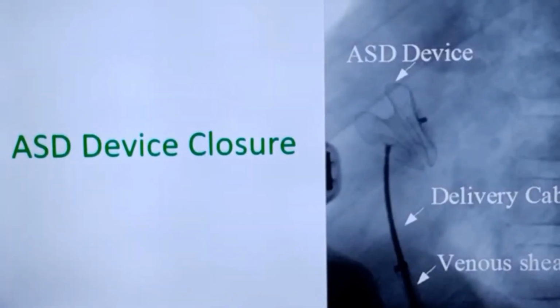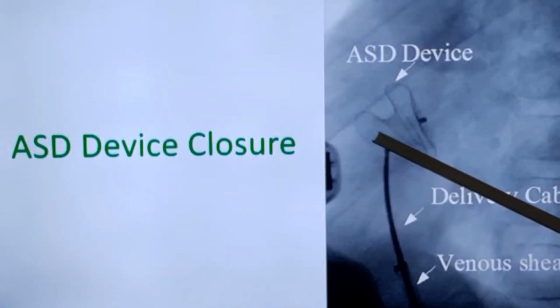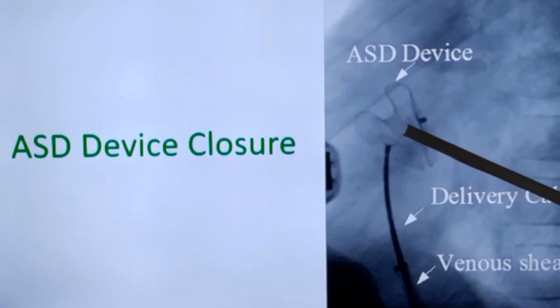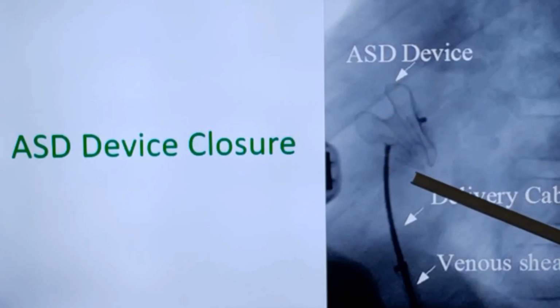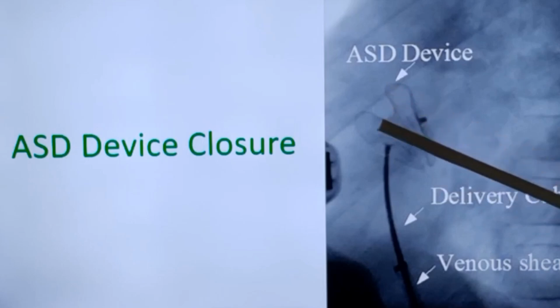This is a fluoroscopic image of device closure of atrial septal defect. The venous sheath has been introduced into the inferior vena cava and right atrium, and this is the delivery cable still attached to the device. This is one flange of the device, this is the other flange, and there is a waist in between. So you can understand that this is the region which will go and attach on the rims of the ASD. You have a rim, the flanges here as well as here.